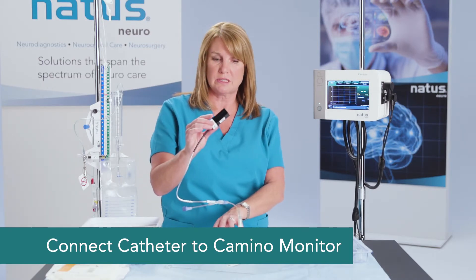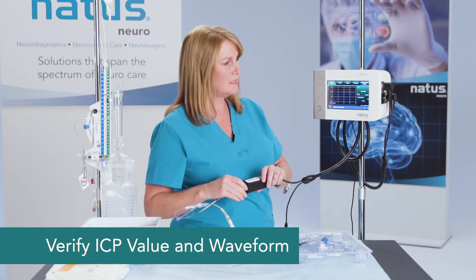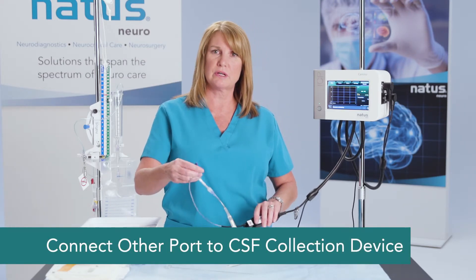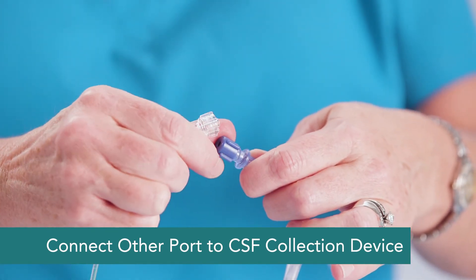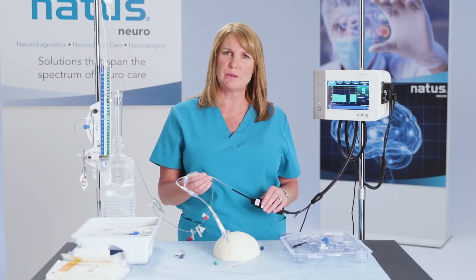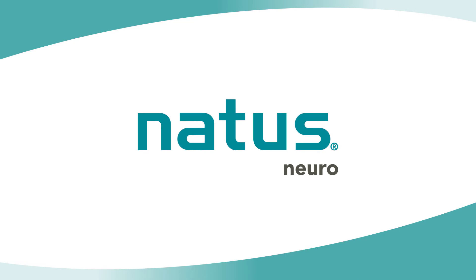Your catheter is placed. Now we just need to connect this up to the appropriate monitors. We want to connect the fiber optic catheter to the Camino. It's going to initialize and then we wait for an ICP value and a waveform to show up. The other port on the catheter is what we connect up to the CSF collection device. That concludes the insertion of a 110-4-HM or 110-4-HMT catheter.